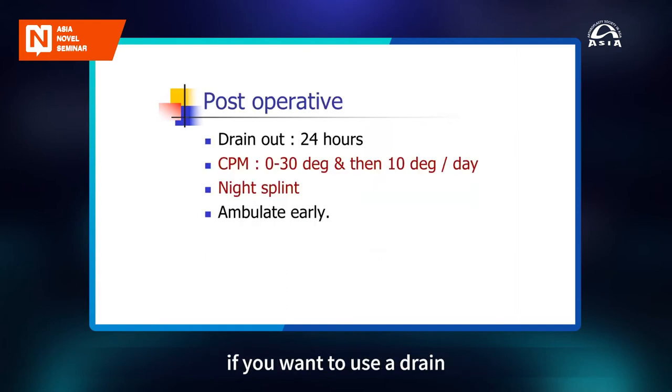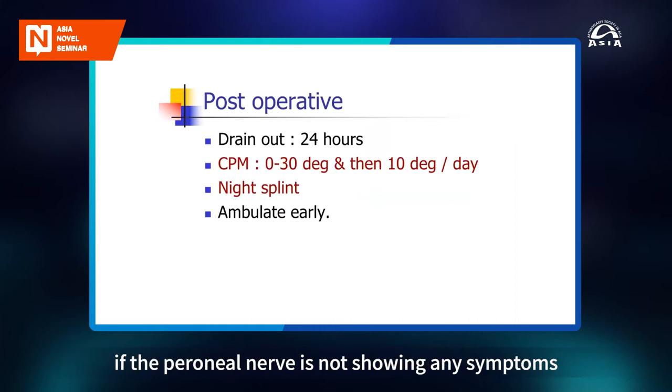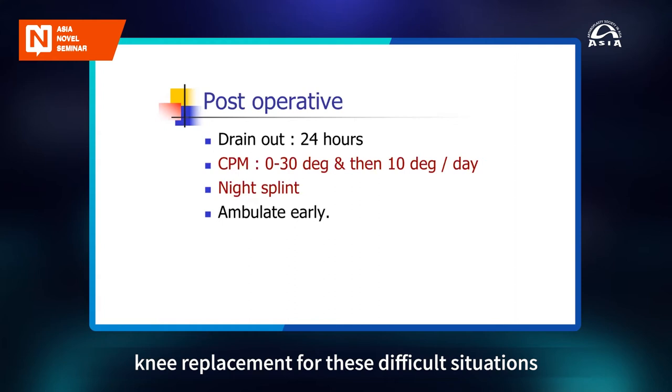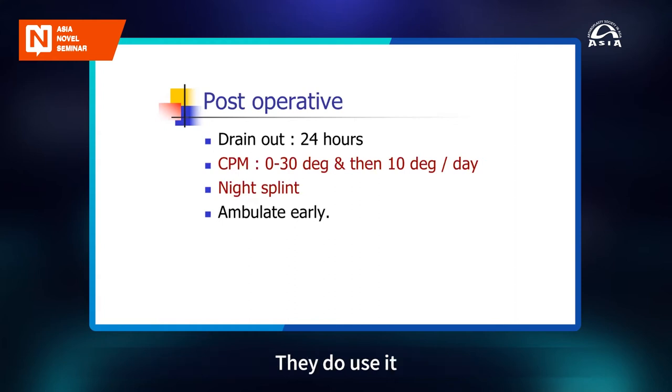Post-operatively, it's up to you if you want to use a drain, but if the peroneal nerve is not showing any symptoms, we immediately start the same day using a CPM machine. We don't usually use a CPM machine for knee replacements, but for these difficult situations, we do use it. Also because in these cases, the muscles have not been going through full exercise. And second, we want to restrict the amount of flexion in the beginning.